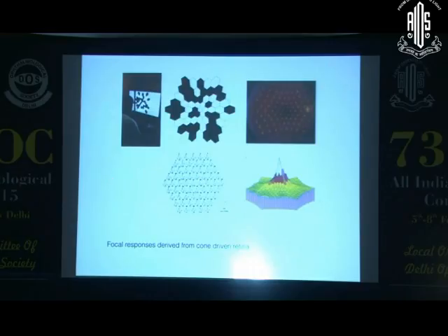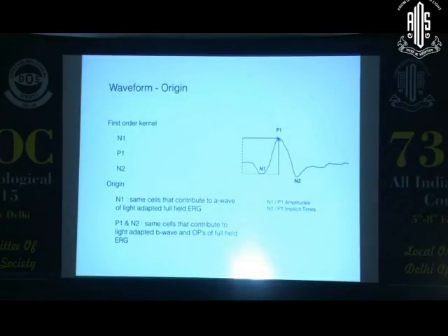Now, if you look at each of these waveforms, it has a typical pattern. It has a waveform which we label as N1, P1, and N2. These are something called first order kernels. Don't get into what these kernels essentially mean by waveforms.